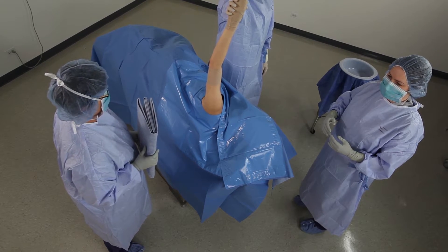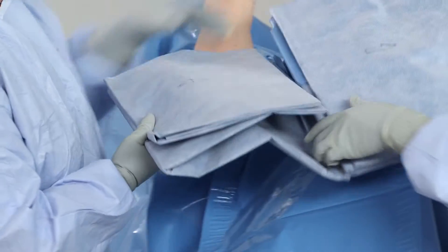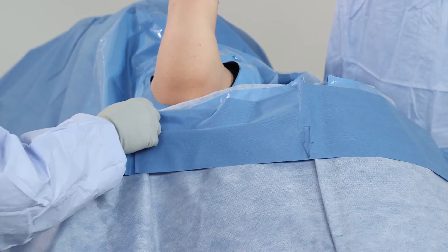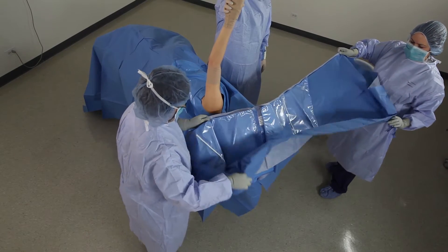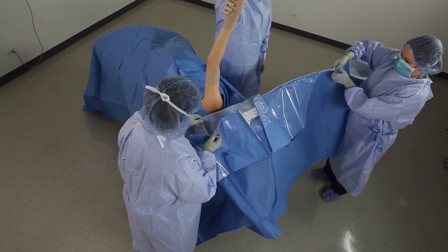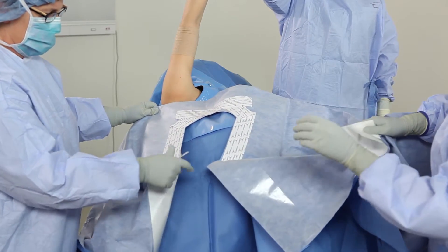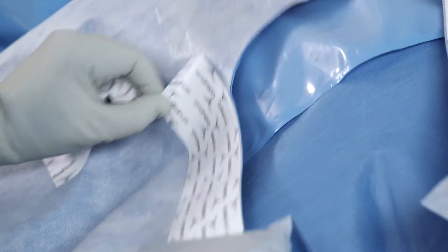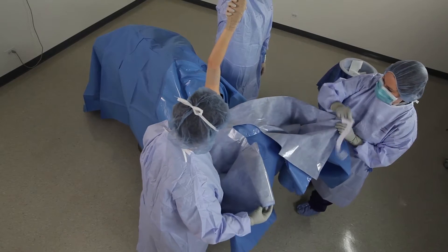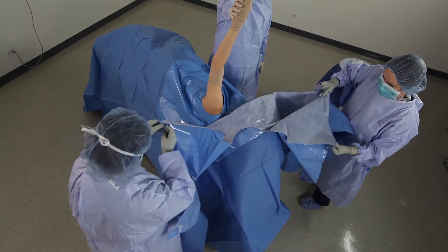First, place the body split drape. Follow directional markings for placement of the shoulder split with Fluid Control Pouch. Unfold to the sides, then unfold to the top. Remove adhesive liners to expose adhesive. Secure the split fenestration around the patient's shoulder joint.